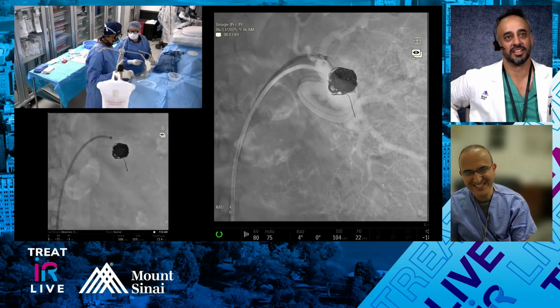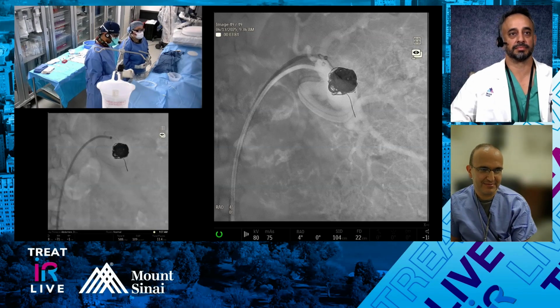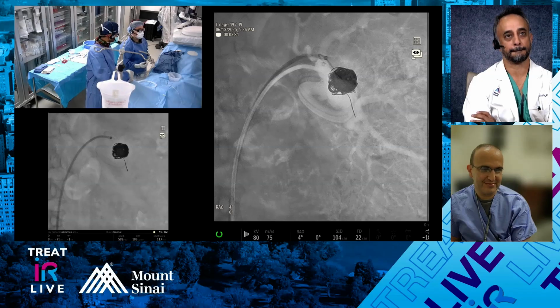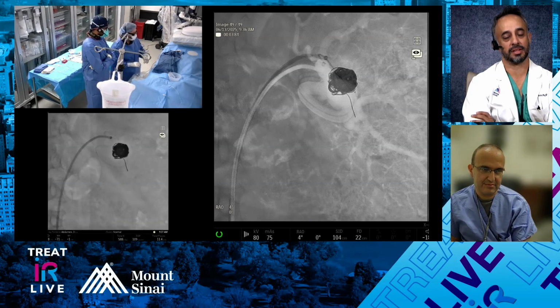Here's food for thought. Can we get forward on the side flush, please? Just for like 2 seconds, and then stop. Sometimes we deal with really large aneurysms. I mean, insane aneurysms, whether it's in the portal system or someplace else. Let's say 30 millimeters or, God forbid, 40 millimeters. What do you guys use for that? Do you try and use 035s? Do you stick to 018s?